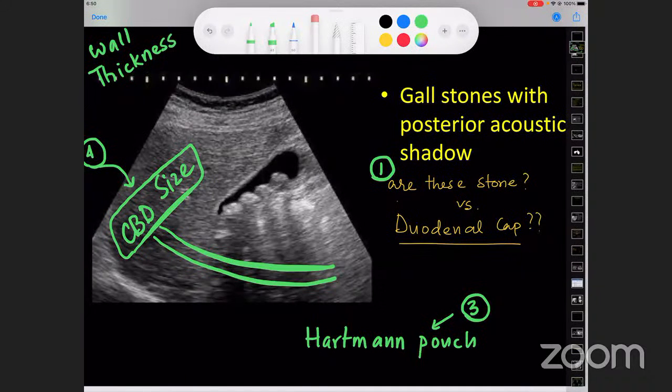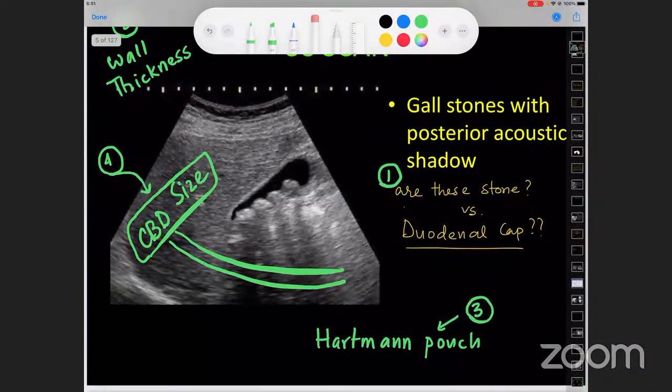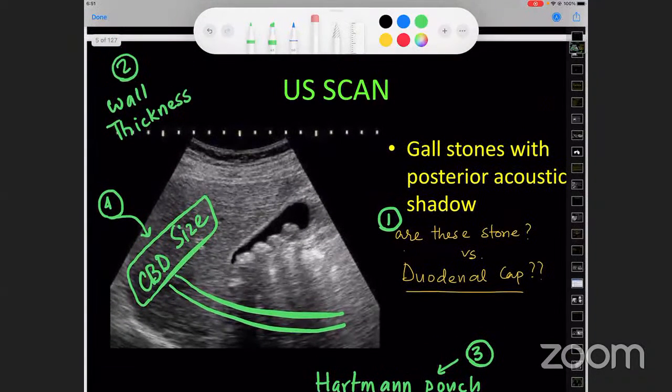I have two questions, please. Dr. Avik Bhattacharya, Avik, two questions. Sometimes you have a contracted gallbladder, and the patient has had an ultrasound scan of the whole abdomen. The patient usually comes in having had a fair amount of water. Normally, water shouldn't cause a gallbladder contraction. But sometimes, just sometimes, I find that if you do an ultrasound scan on an empty stomach, it visualizes the gallbladder better. Is that wrong on a surgeon to think that?